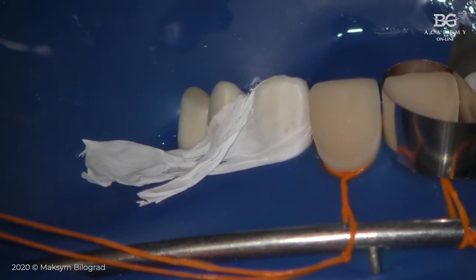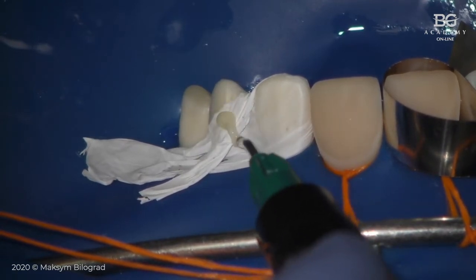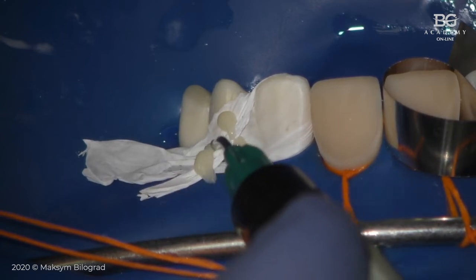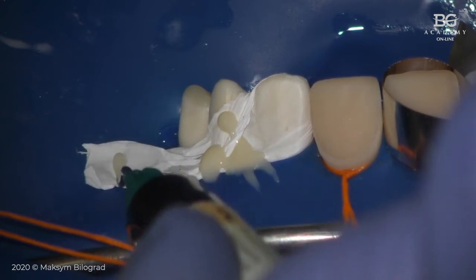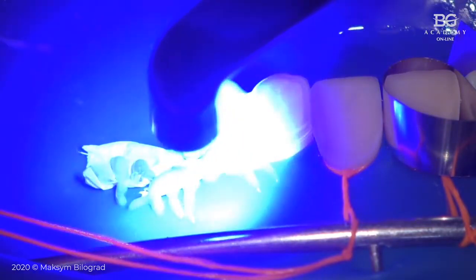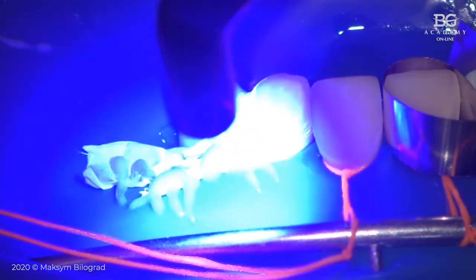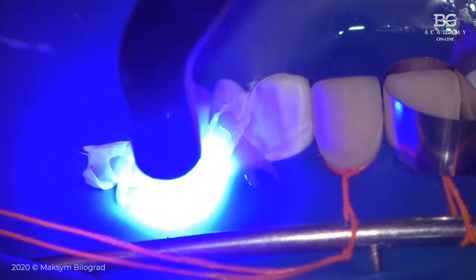So in this case, what you can do is take a flowable composite and stabilize your Teflon towards rubber dam, you see, with flowable composite, like this. And then you can dry, you can do whatever you want. Okay, good.